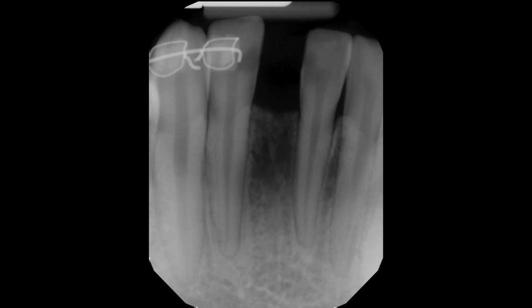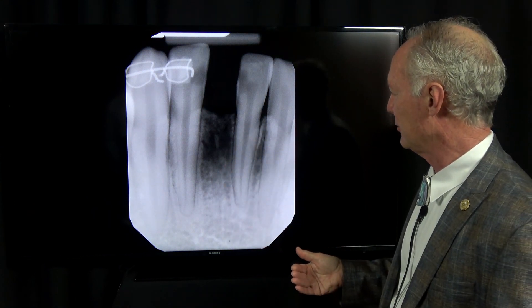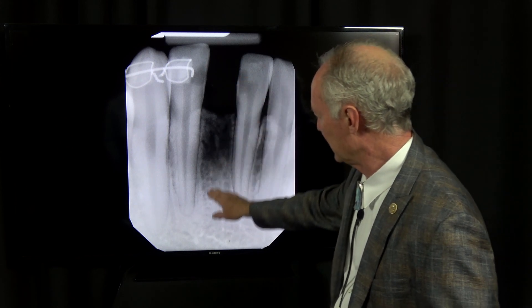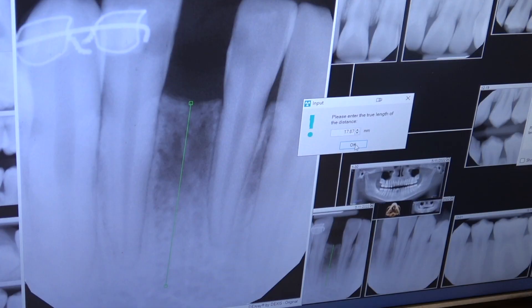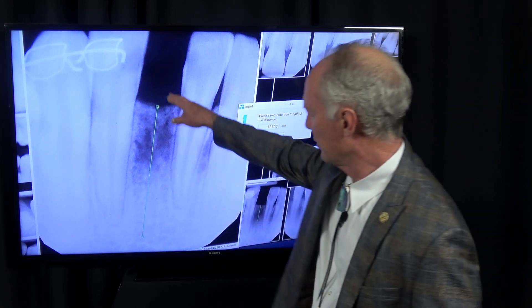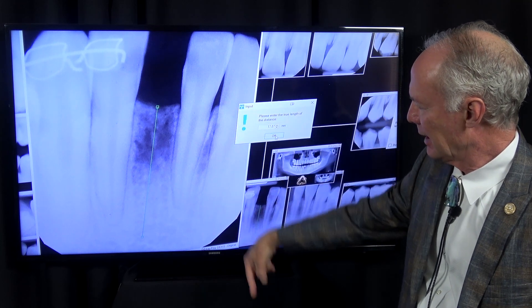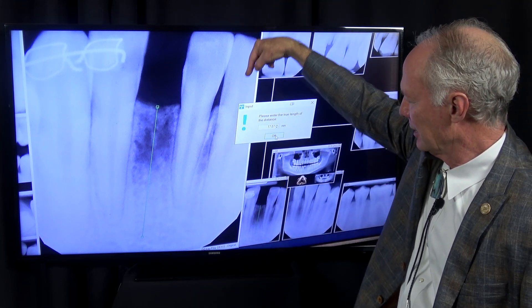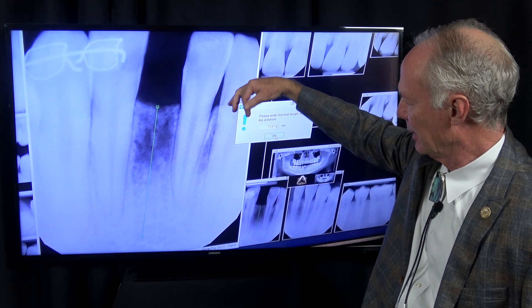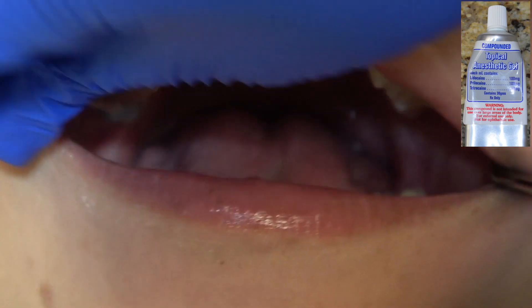But it's complicated — I'm going to show you why. It worked out well, but I'll show you why. This bone is typically very thin on the facial, and even if you've got a millimeter of bone around the coronal part of the implant, chances are you may not have a millimeter all the way around it as you go apically into the alveolar process. We've got plenty of room here — we're not worried about drilling into anything — but keeping the pilot drill straight is key. I'm going to drill to depth with the pilot drill to control the angulation of the implant, because if you don't, that implant will travel and move side to side or facial-lingually. I want to control the channel that the implant will be traveling on.